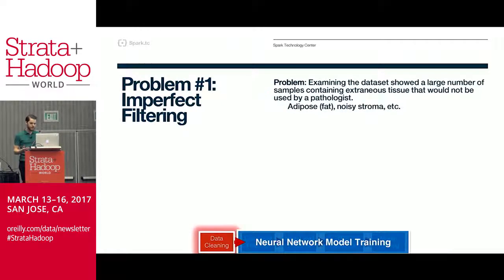But it's an interesting problem because, for deep learning, one of the initial things you would think of is, how about more data? Well, at this point, we have 4 million samples, almost 3 million in the training set, and say ImageNet only has about 1.6 million for their classification task. So maybe not data. What about overfitting with your model? Your model's just too expressive. Well, we started with a pre-trained model, so we have a good initial starting point, and we've limited it by freezing most of the model, so we're not actually allowing the model to change most of its weights. We're forcing it to learn based on weights it's learned from different tasks. So maybe not that either.